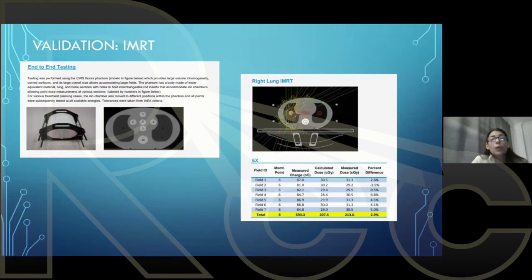And we also went back to the literature, comparing DLGs that you measure. There are multiple papers where they end up using a slightly different factor, because sometimes it doesn't quite work as well, the value that you measure versus the value that is really needed in the treatment planning system.